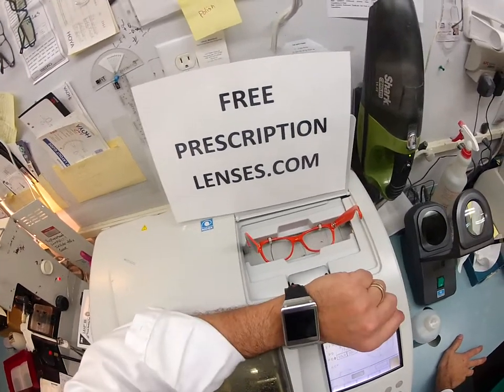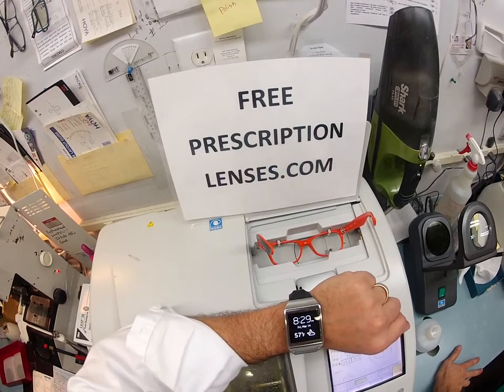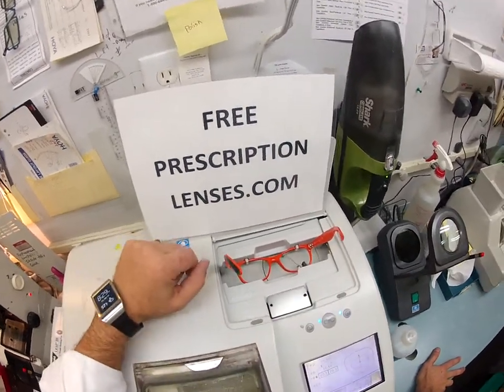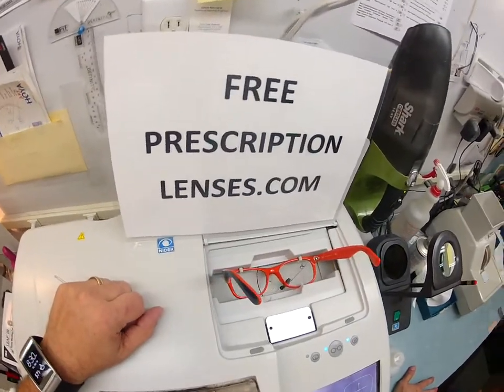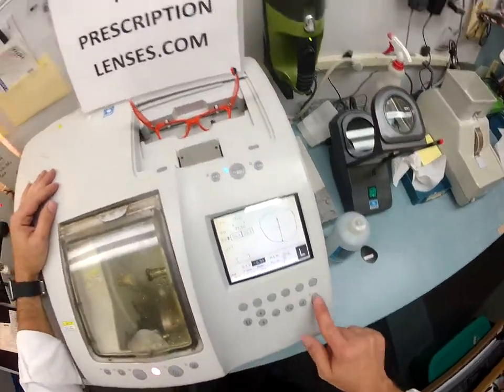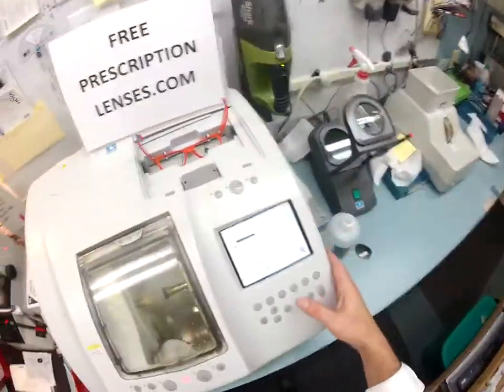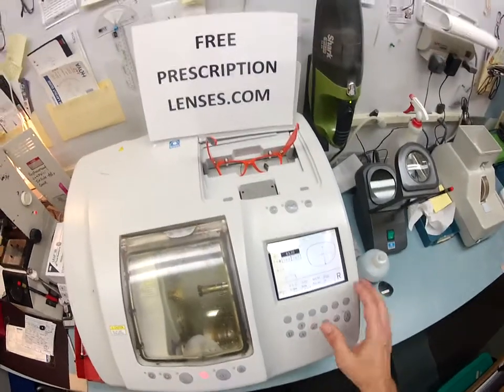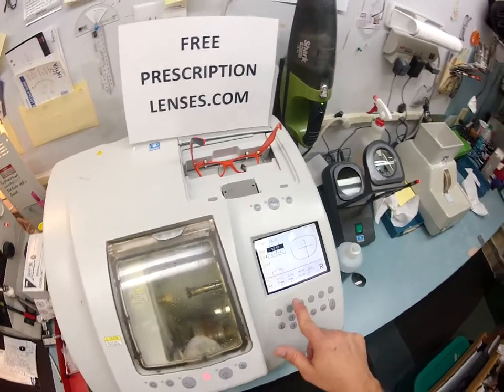This whole process takes about 20 minutes. It's 8:29 on Friday, March 14th, 57 degrees in my hometown of Durham, North Carolina, at least according to my Samsung Gear watch. It has traced the shape of your right lens. We'll pull the shape up on the computer, put in your pupillary distance, and this is a polycarbonate lens cut for a plastic frame. Let's get everything blocked up.